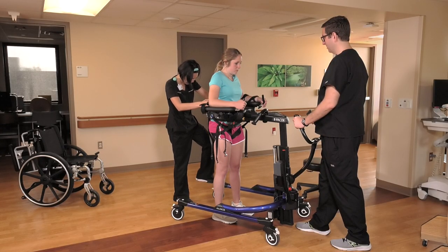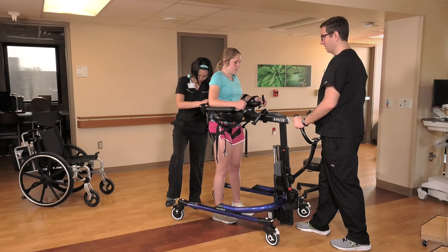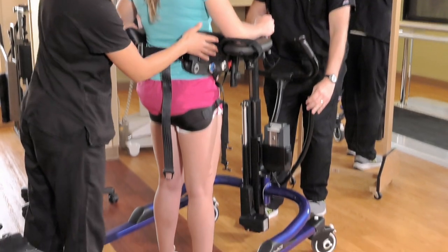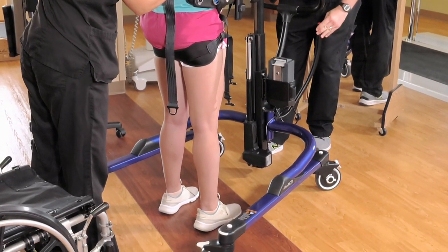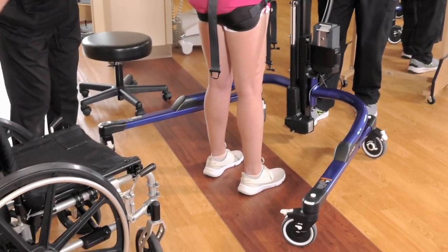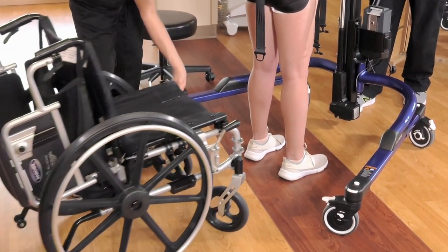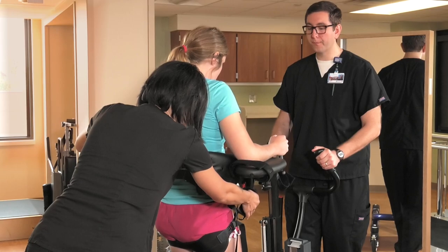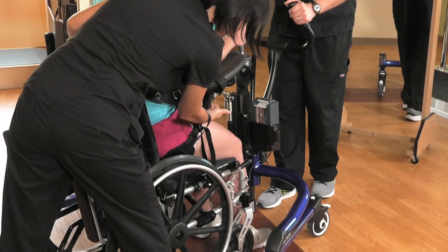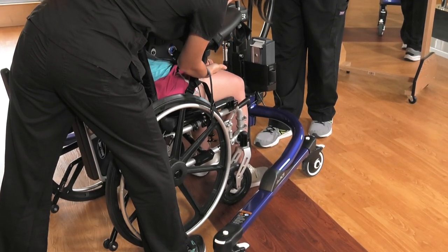To return the patient to the wheelchair, unlock the rear brakes. Stabilize the E-pacer while an assistant unlocks the front casters. Use the expansion handle to spread the base legs and bring the wheelchair behind the patient. Make sure the patient's feet are clear of the base legs. Push the E-pacer forward as you lower the patient into the wheelchair to ensure that her hips are in full contact with the backrest.